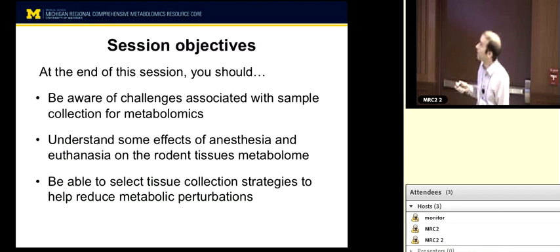The order of collection was gastroc muscle. This was a representative muscle; we could collect various other muscles from the rat. This is done because it's peripheral, and under the modes of anesthesia we were testing, we wanted blood circulation intact as long as possible. So you can do a collection here which, although there will be some blood loss, will not disturb things.